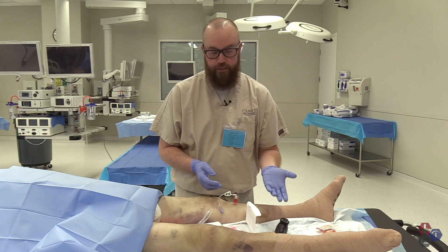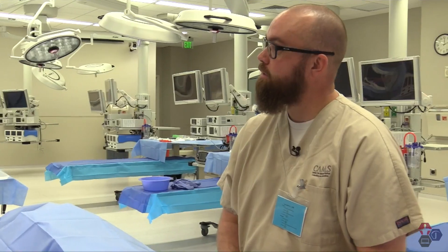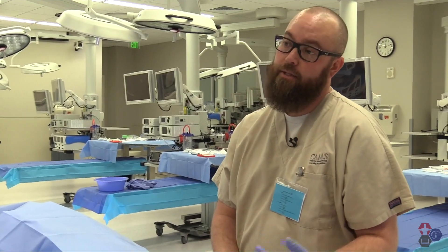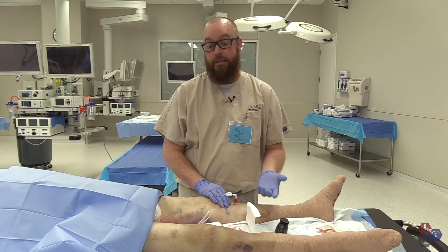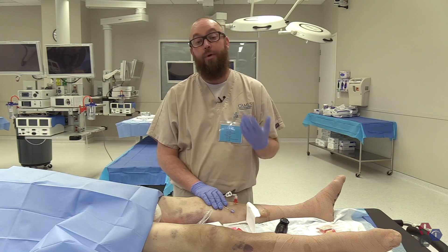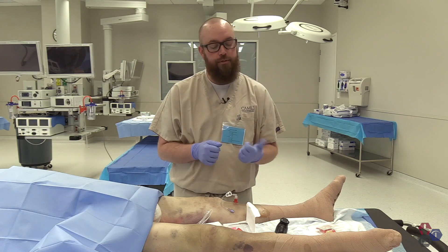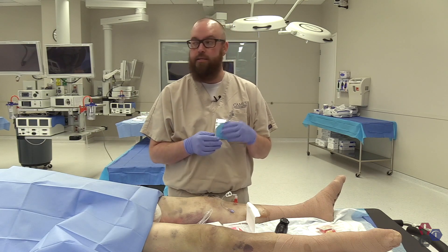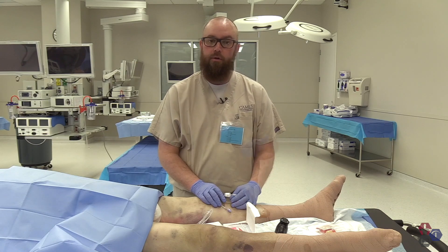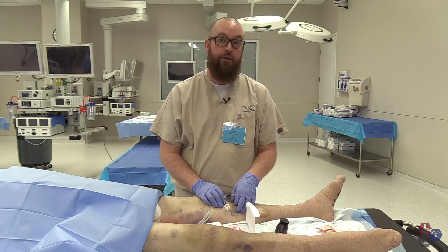Contraindications include osteoporosis, osteogenesis imperfecta, overlying skin infection or abscess, and previous IO cannulation at the same site, as well as a fracture of the bone. In conclusion, the indications are anytime you need quick access for medication or infusions, either in a resuscitation event or when intravenous access is not readily available.